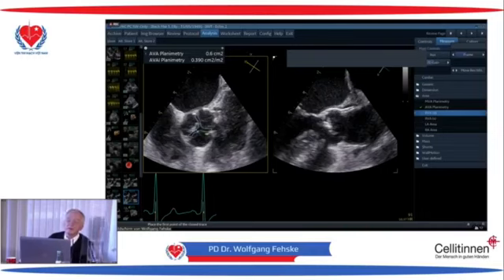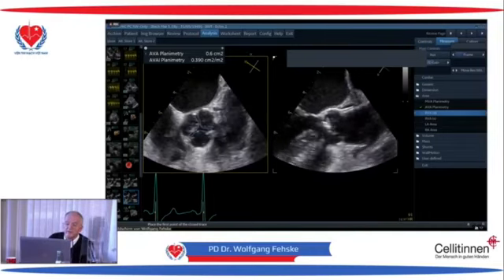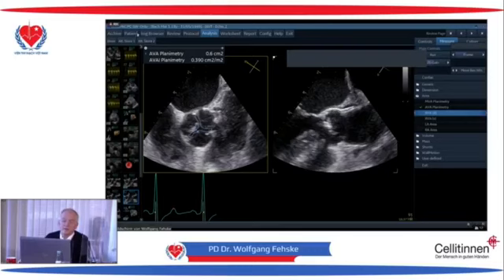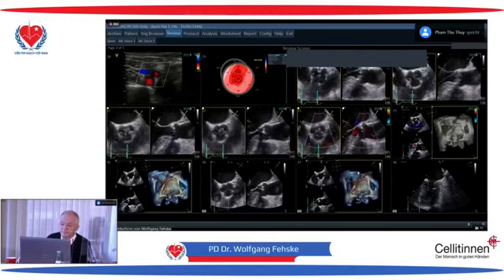It is a little bit smaller. Let's look if that is, I believe that there is, no, it is exactly that what I found. Is it okay? Do you agree? So I did this because I did the examination yesterday in the afternoon. So we'll see.